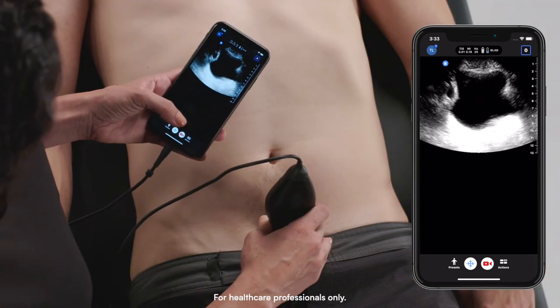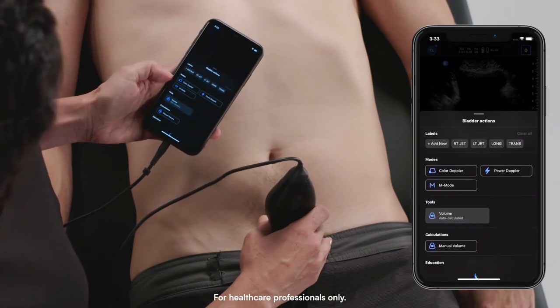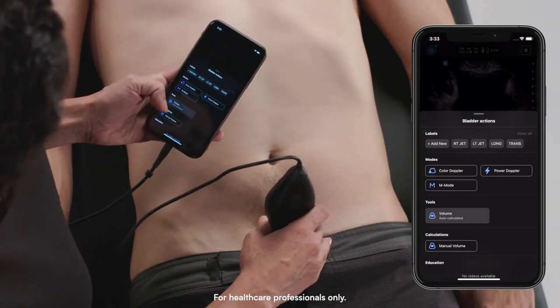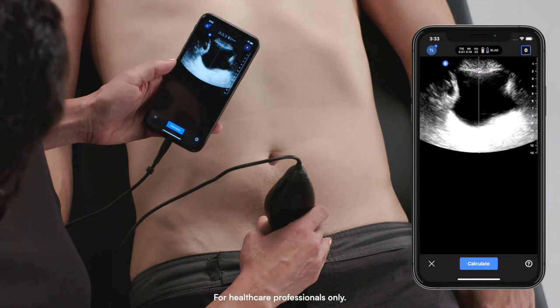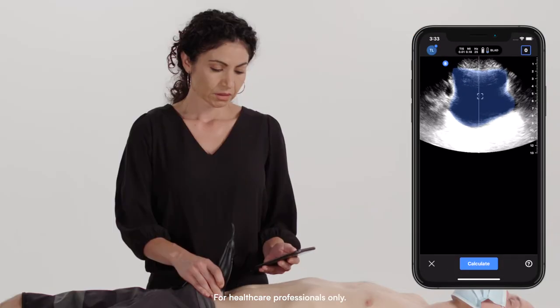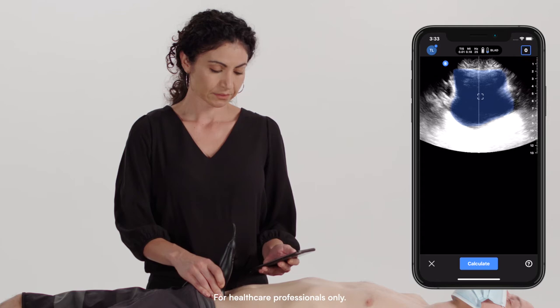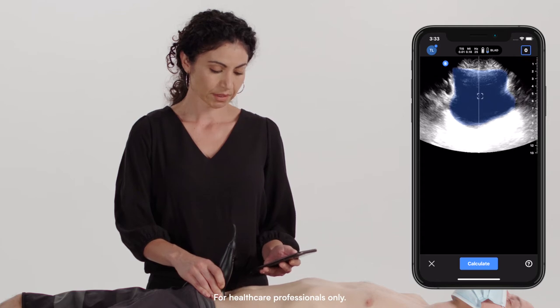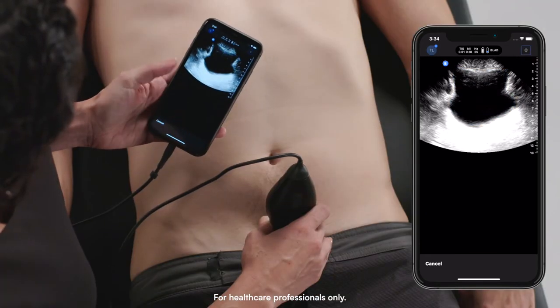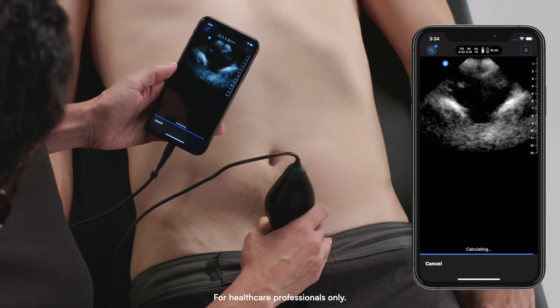To calculate bladder volume, I'll tap on my Actions menu and I'll select Volume under the Tools section. You'll see the bladder is highlighted by our blue overlay. To calculate, I'll tap the Calculate button, and you can see how fast the scan is.